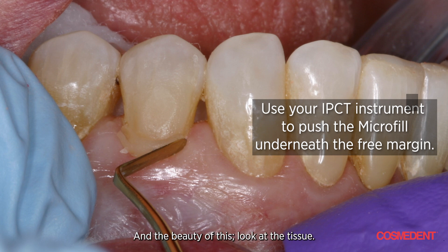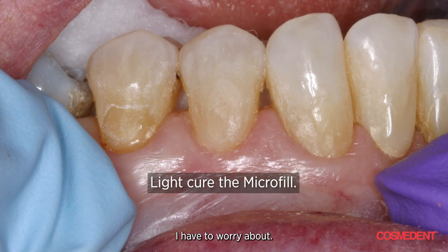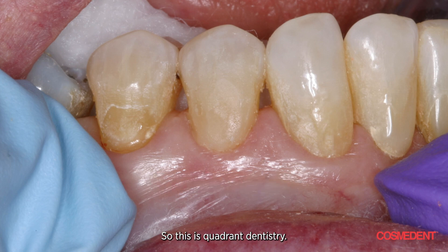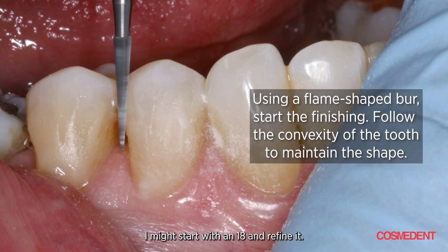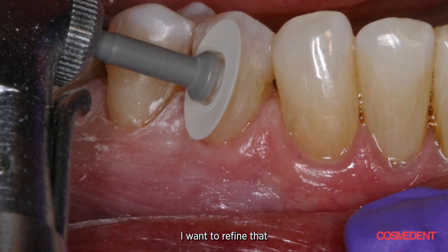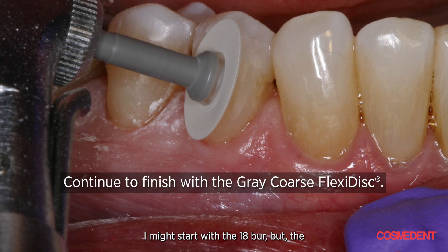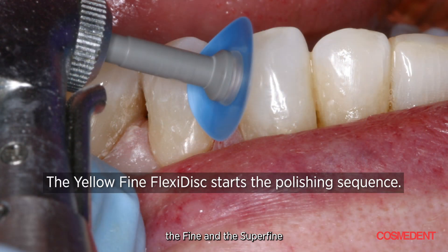The beauty of this — look at the tissue, it's impeccable. I can do all three at one time, finish all three at one time. No contacts to worry about, so I can do this in quadrants — this is quadrant dentistry. I might start with an ET bur, tip it away from the tooth surface, then go up towards the occlusal. To refine and blend it, I use a disc — starting coarse to feather-edge that margin down to the tooth surface where you can't find it, then going through medium, fine, and super fine. You can see the flex in the disc.